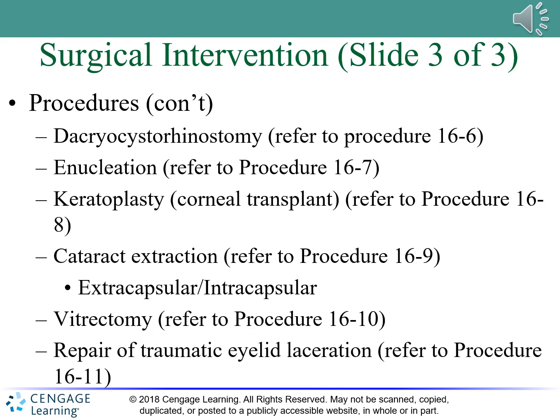Evisceration allows the retention of the sclera and extrinsic muscles of the eye. It eliminates corneal sensitivity and allows the patient to wear a prosthetic eye that will have mobility and a better cosmetic result. Okay, so on 609, again under pre-op preparation, there's that anesthesia, the retrobulbar block. Okay, so we are taking out the eyeball.